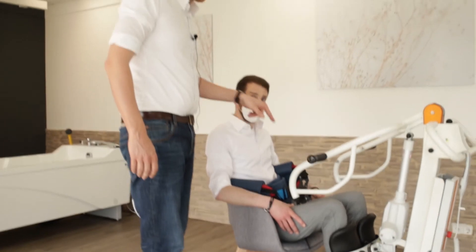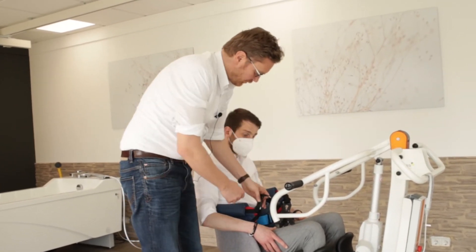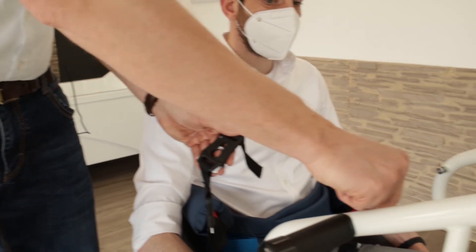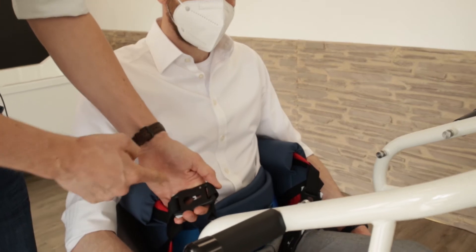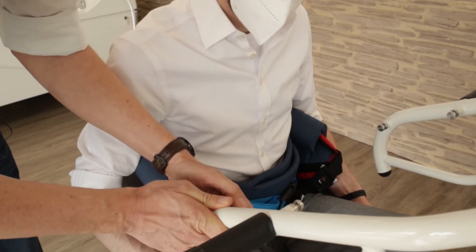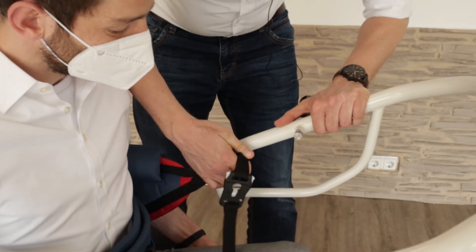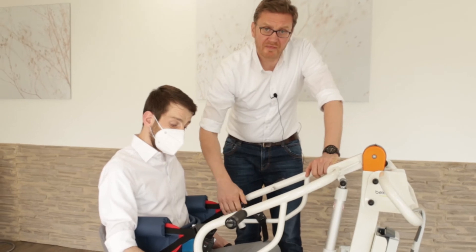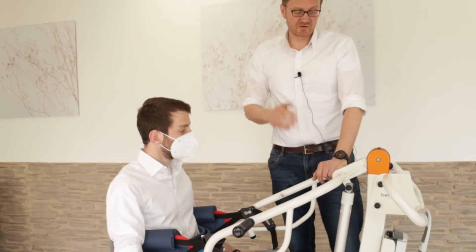Now we come to the point to connect the sling with the Nora itself. We have two connection points. If we have a small resident, we can use our second connection point here on the Nora with our second clip. But in this case, I would use this clip with the first connection point. So we ask the patient to lean a little bit forward. And connect him with our clips. Always be sure that the clips are really connected to the connection points. And now we're ready for the lifting process.